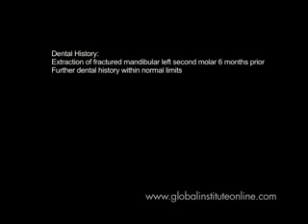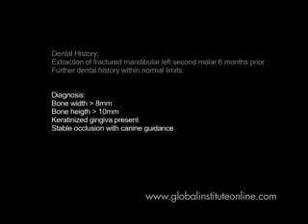This case will demonstrate the replacement of a missing lower molar. The dental history is that there was an extraction of a fractured mandibular left second molar, which was extracted 6 months prior. Further dental history on this patient is all within normal limits.